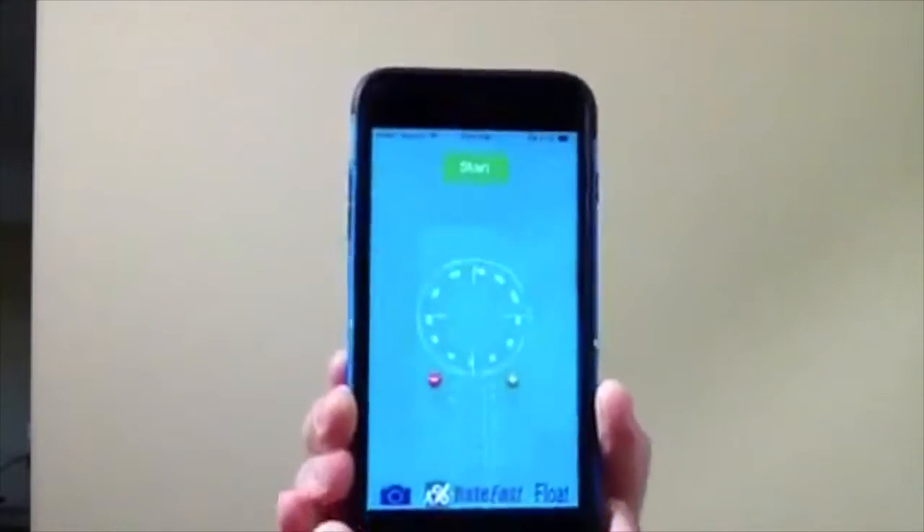To put the RateFast Goniometer into ghost mode, simply touch on the camera on the left lower corner. Now you are looking at your subject through the viewfinder with the RateFast Goniometer over the top of the image.